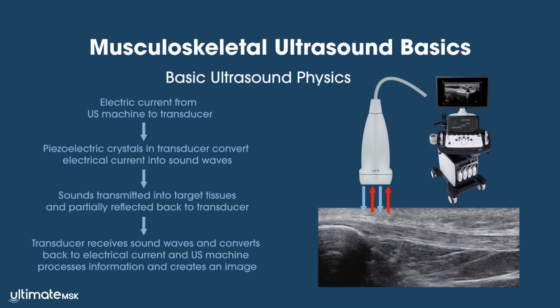When I think about ultrasound physics, I start by comparing the ultrasound machine to a computer. Just as computers have become significantly more advanced over the last 10 to 15 years, so too have ultrasound machines. The technology continues to improve, and the resolution of images produced by modern ultrasound machines is much improved from those even a decade ago.